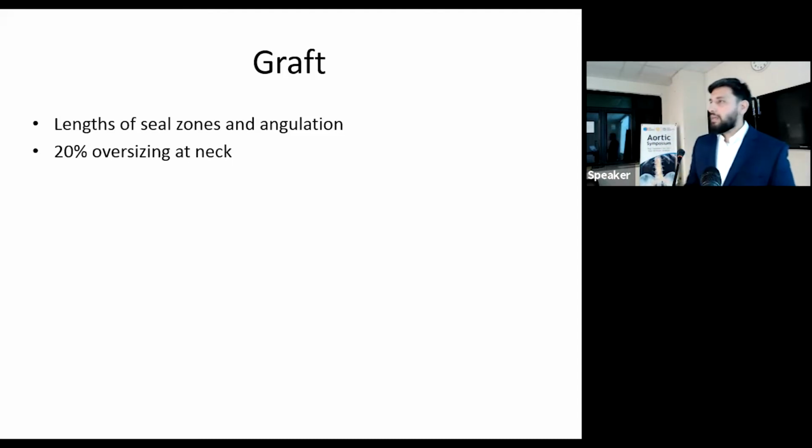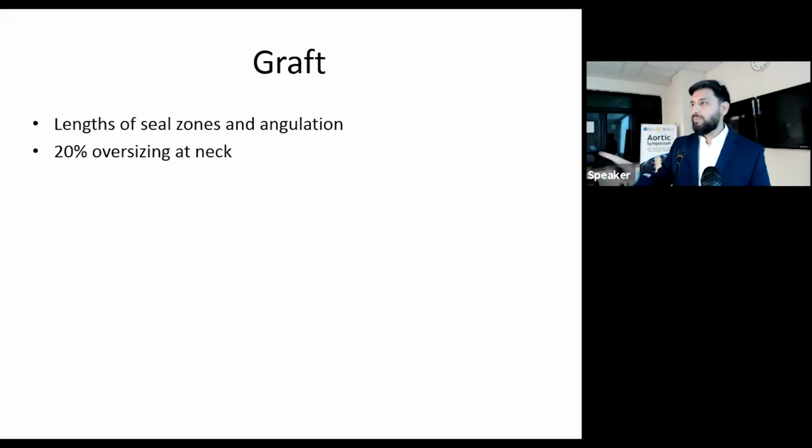Most of these companies will give you sheets. So you find a cheat sheet, you measure the diameter, you dial it into the cheat sheet, and it tells you what stent graft size you need. But it's good to have a mental idea, particularly if you're doing ruptured aneurysms and things like that, of what the working behind that is.